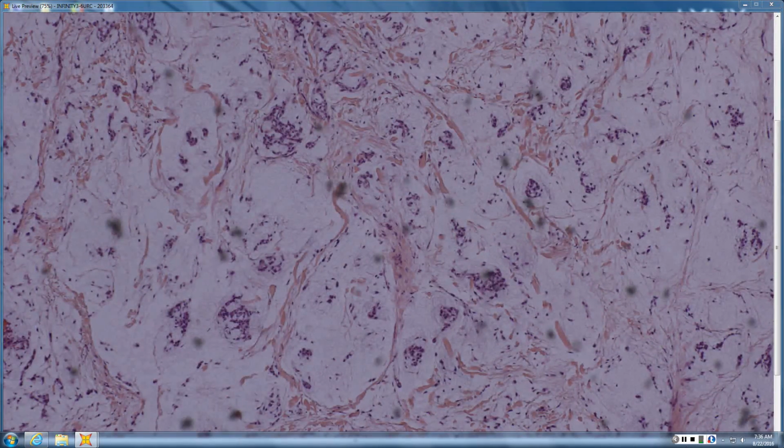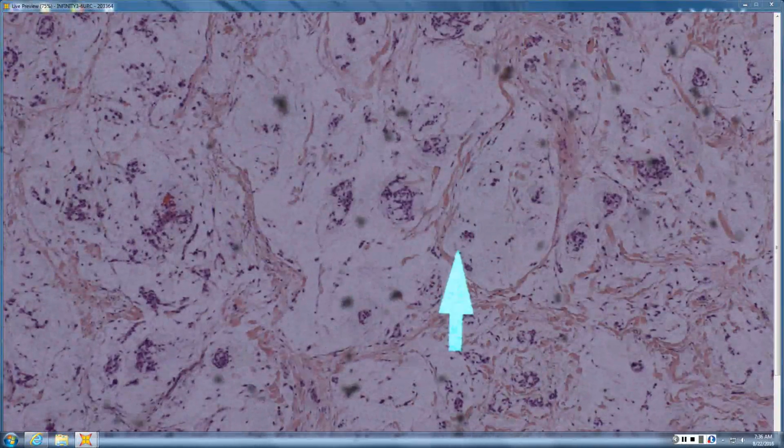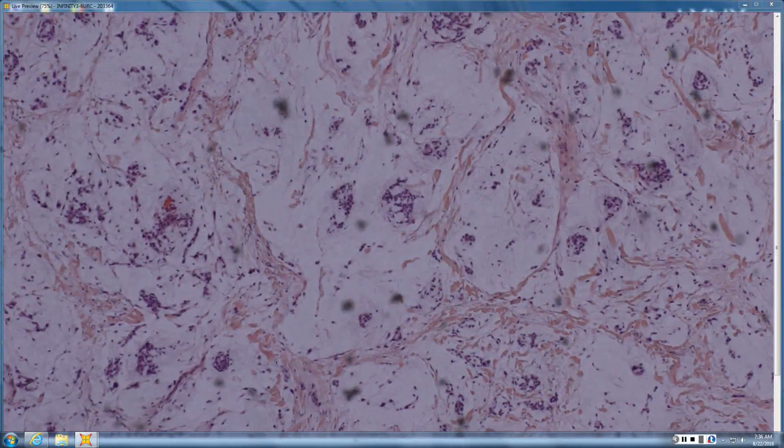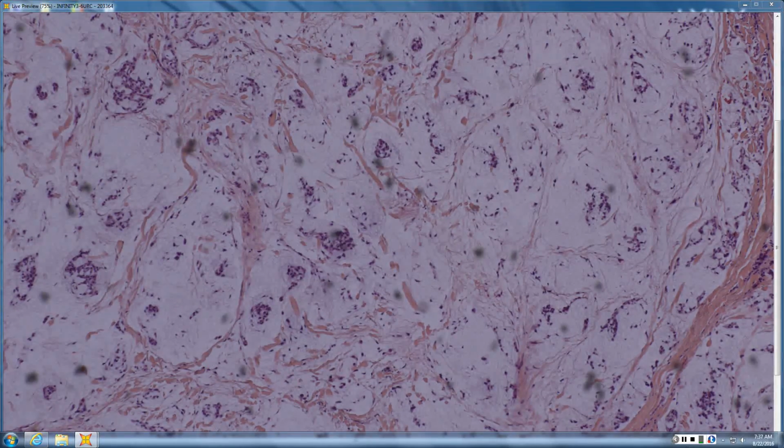So Paige, what do you see? So it looks like a dermal lesion. It kind of has the paisley tie pattern, potentially. There's certainly some islands, and are they sitting in dermis, or are they surrounded by some other kind of material? I guess they're more so surrounded by another material. So, Shane, could you come up with a really poetic description of what you're seeing? Exactly. So, blue islands floating in a sea of snot. Pure poetry, right? Mucinous carcinoma?